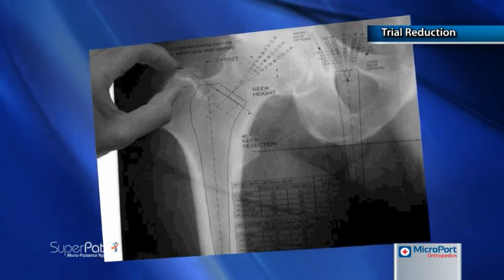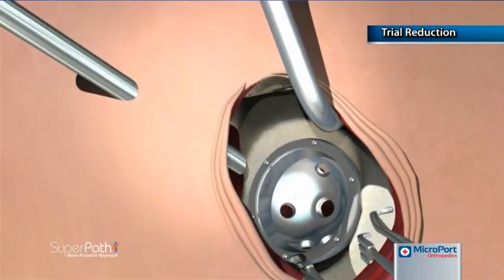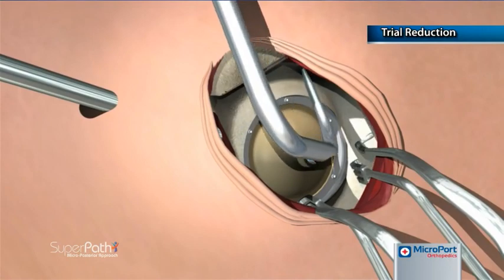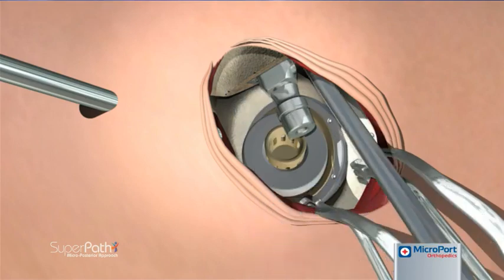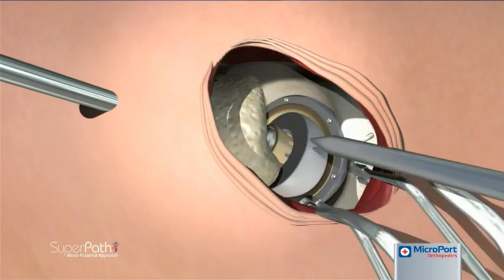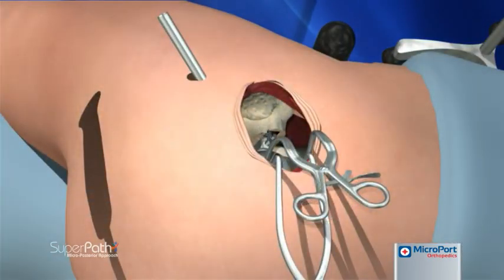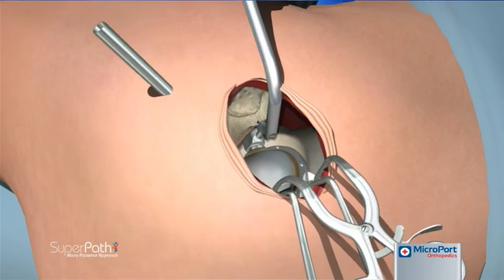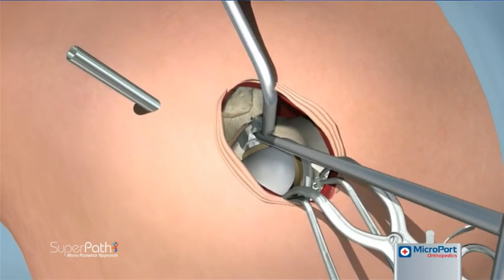Head and neck trials are selected by measuring the resected femoral head or by preoperative templating. The trial neck is seated into the femoral broach, while the trial head is placed into the cup with the opening in a superior posterior position. With the tip of the blunt trocar inserted into the top of the broach, the leg is translated to mate the trial neck into the trial head. Raising and lowering the foot of the operative leg assists in the maneuver. With the leg returned to the home position, the bone hook is inserted into the broach and lateral traction is applied.